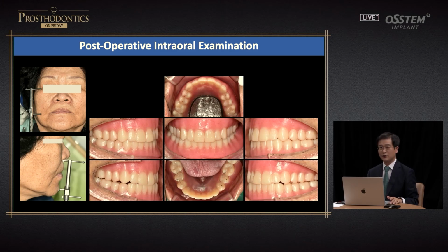And we scan the face of the patient, so we create it to meet the facial structure of the patient. And the pink resin has already been cured before being milled, so the VD did not become high.